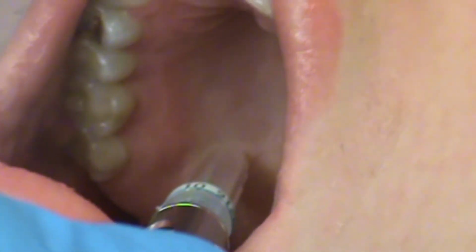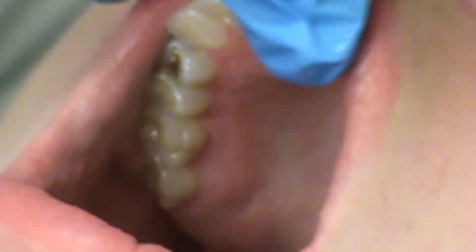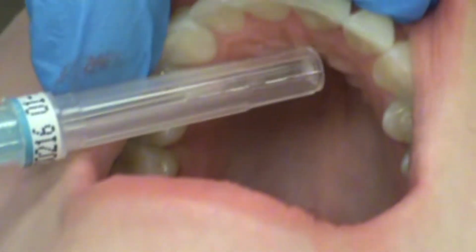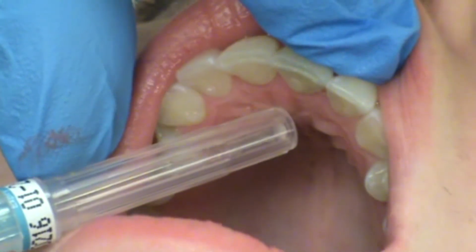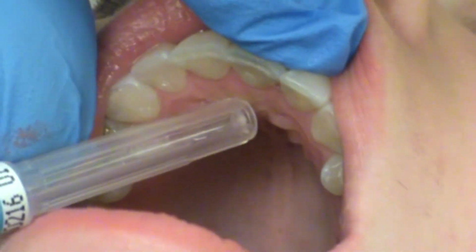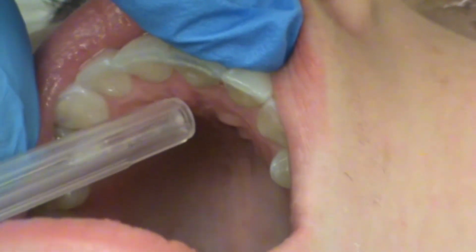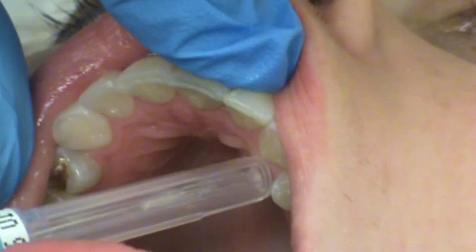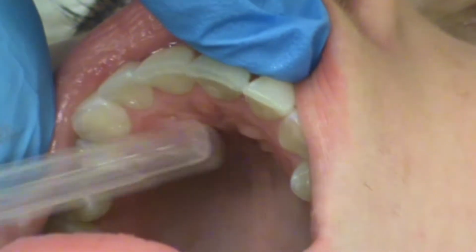So you would put topical there and inject slowly to numb up all of the tissue from the maxillary tuberosity to the canine. The nasopalatine injection is underneath this little football here. She has perfect representation. The nerve comes out of the nasopalatine foramen kind of low, lower than it looks. So your injection ideally is right about here. So you would inject right there to numb up the tissue, just the tissue only, canine to canine, with a little overlap with greater palatine.